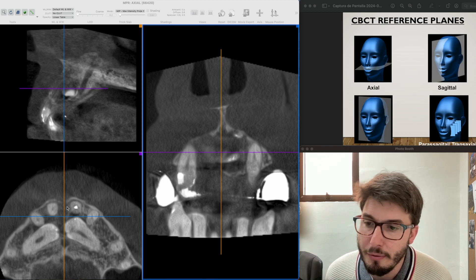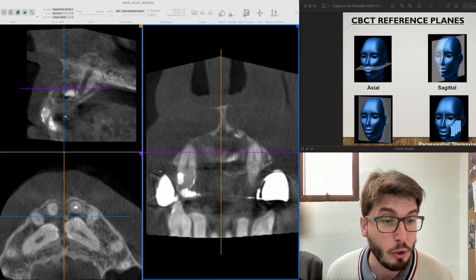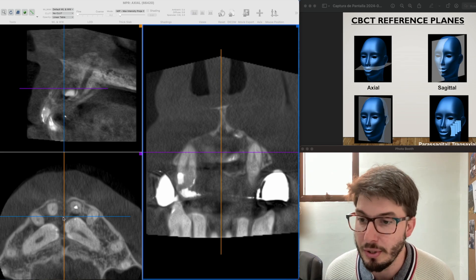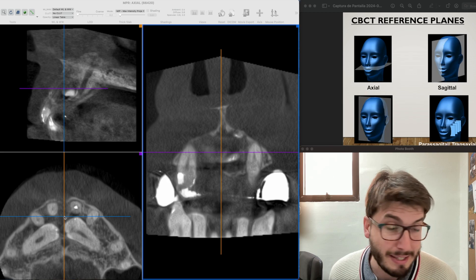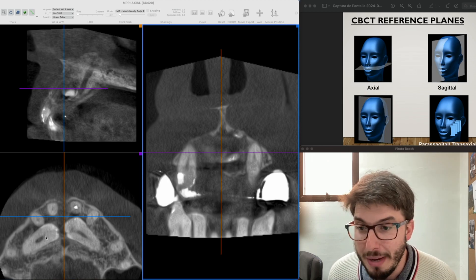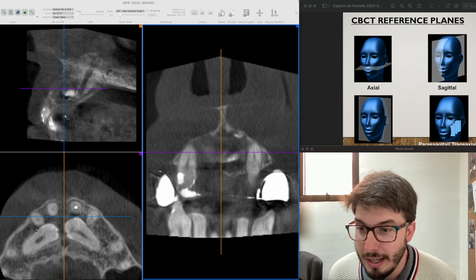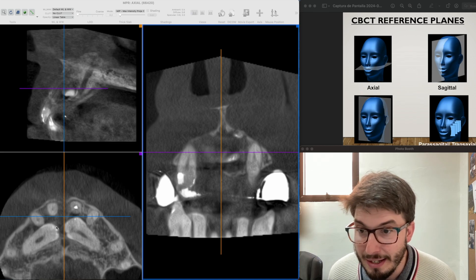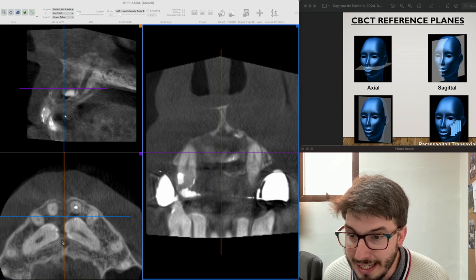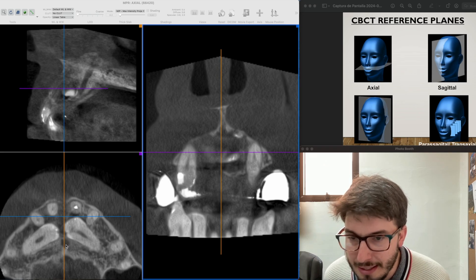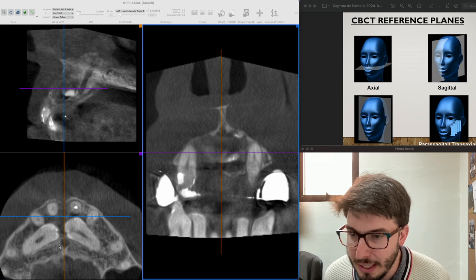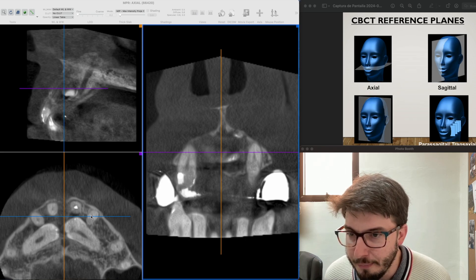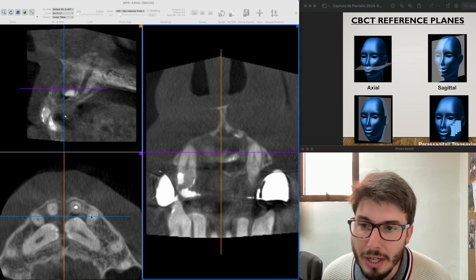Let's see this lesion. We have here a hypodense lesion — since this is 3D we say hypodense — located in the anterior maxilla. We have two impacted maxillary canines that are displaced in the alveolar bone. The nasopalatine canal is displaced towards the palatal direction, and the four incisors are in continuation with the lesion.